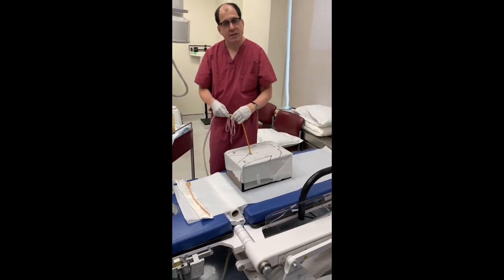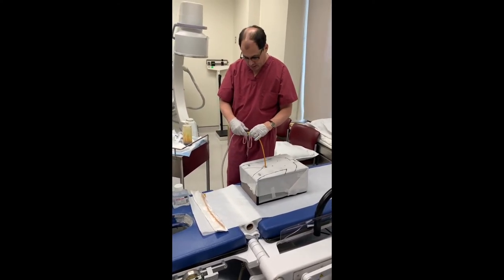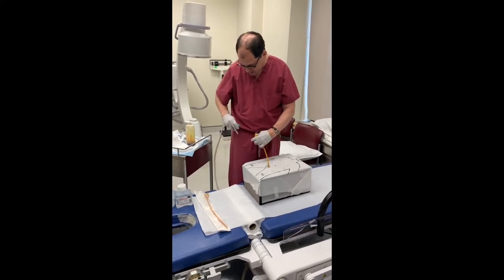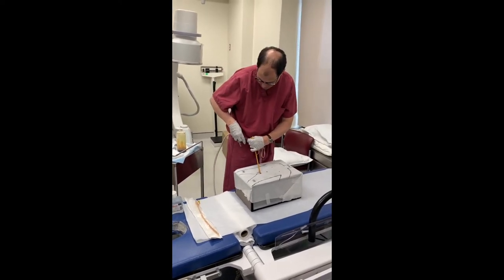The first thing I usually do is take your clip, disconnect it, and clip it to your gown or to the sheet.